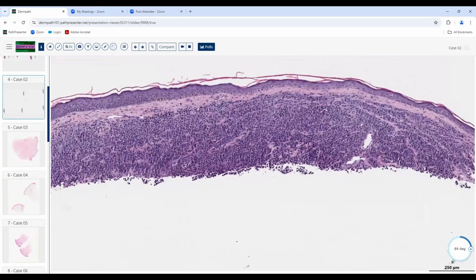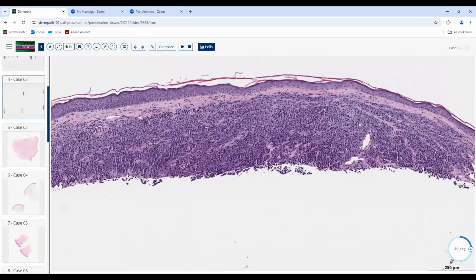They can take on features that look like blue nevi. So if you see what looks like a small puddle of darkly pigmented melanocytes in the dermis, small, not a huge broad area, small little puddle of melanocytes, and a couple of them look like maybe there's a little bit of more slight atypicality, you have to think about the possibility of blue nevus-like metastatic melanoma. Those can be extremely challenging and difficult to diagnose because they look very, very much like a blue nevus.